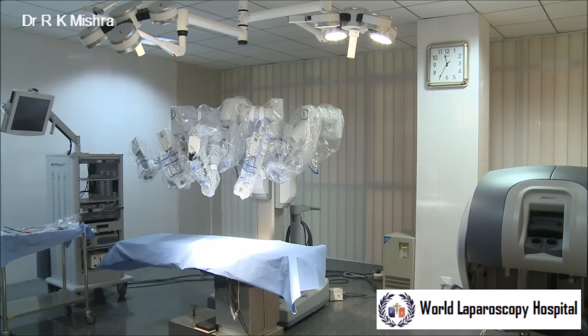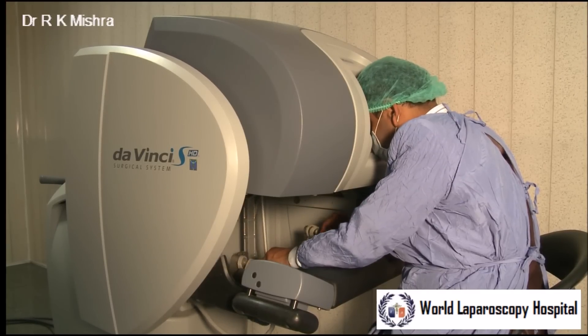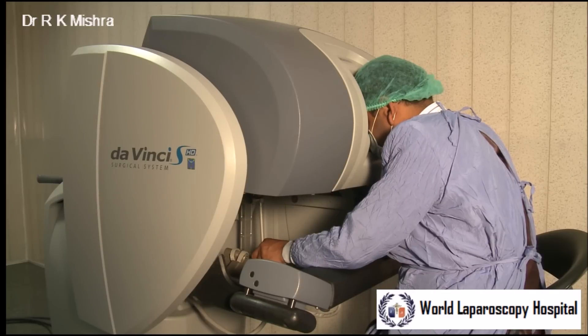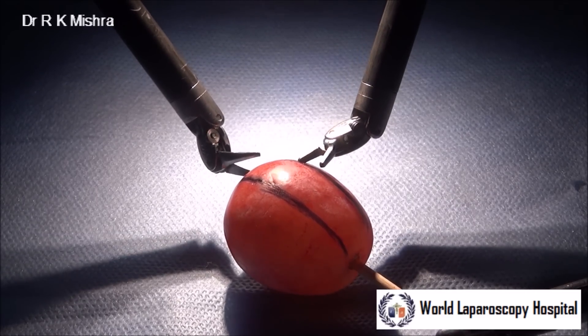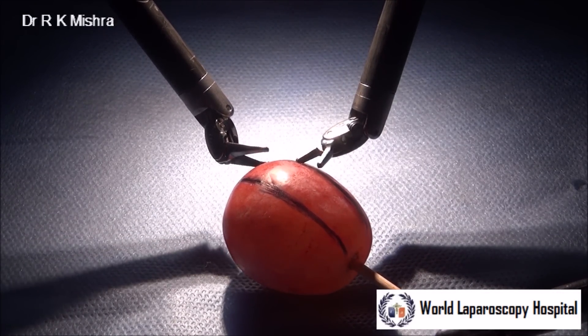You have to take a grape and just draw a line on the grape with a sketch pen, and then with the Da Vinci scissors and one micro needle holder, you can stabilize the grape and start cutting with the articulating micro scissors.